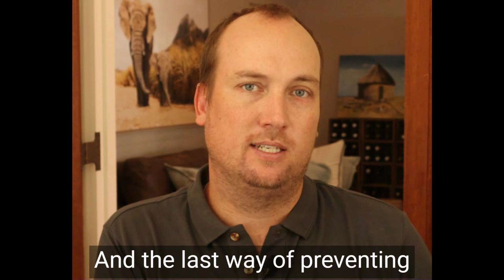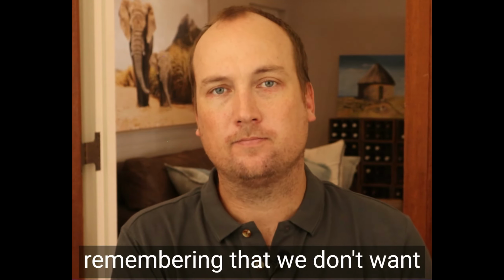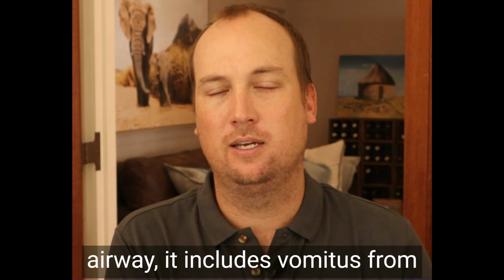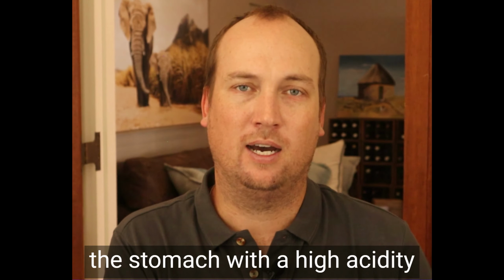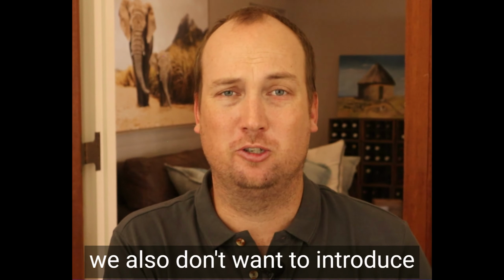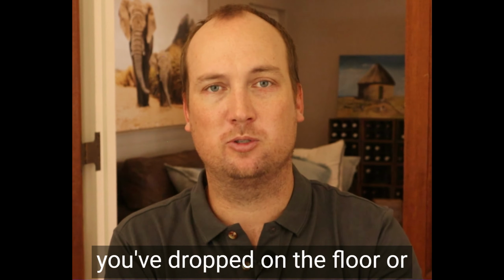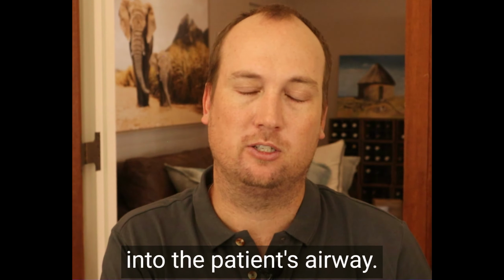And the last way of preventing lung injury is just by maintaining our sterile technique and remembering that we don't want contaminated foreign material to go down into the lungs. So that includes saliva from our airway, it includes vomitus from the stomach with a high acidity or particulate matter. And then we also don't want to introduce hospital pathogens into the lungs. So you don't want to put a dirty endotracheal tube that's been on the patient's bedding, or you've dropped on the floor or something ridiculous like that. You don't want to put that into the patient's airway.